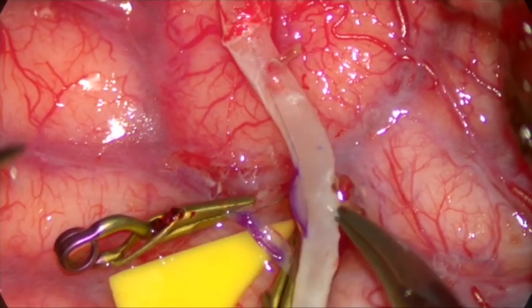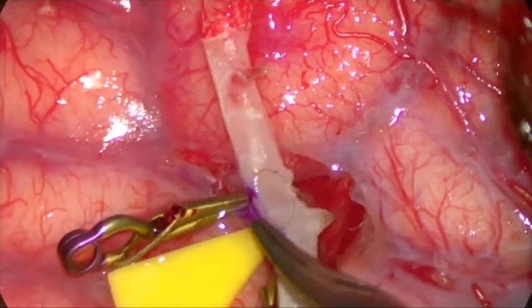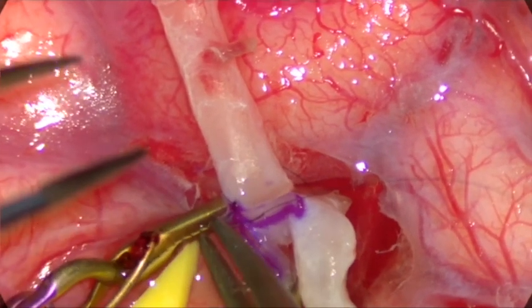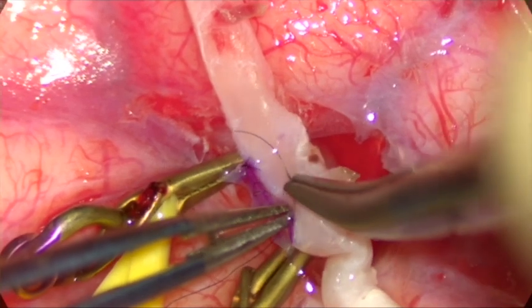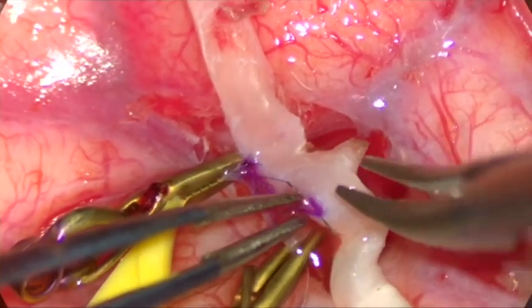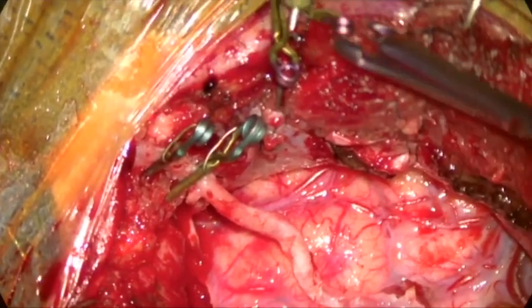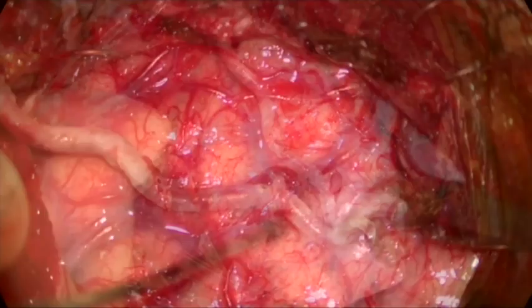The back wall has to be done first, and that's important to do from inside the lumen. The suture is pulled hand over hand, leaving the loops loose and then tightened, and then the front wall of the anastomosis is done. All clips are removed.